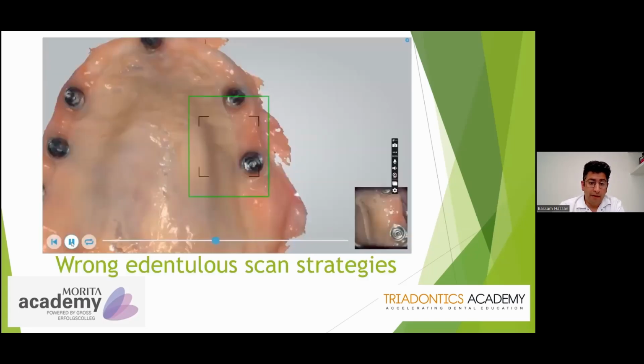So intraoral scanning of full arches is quite feasible, quite possible actually. But that does not mean that because you have AI and amazing scanning technology, very good processing and post-processing, good stitching, that you can abandon experience. You still have to be experienced to do those kinds of scans.